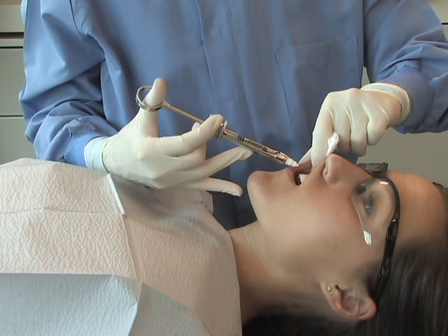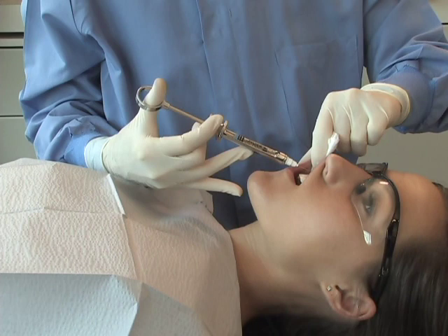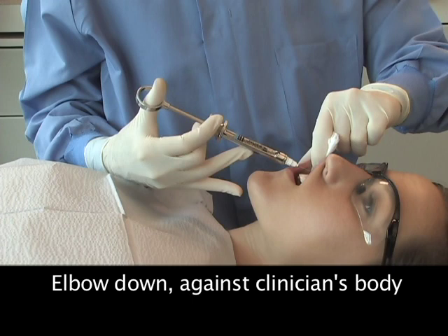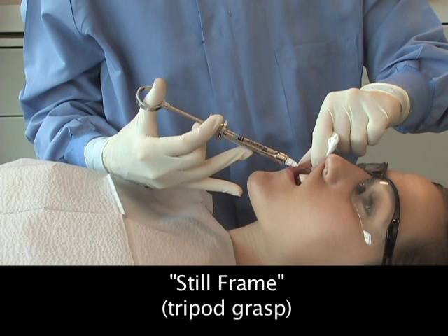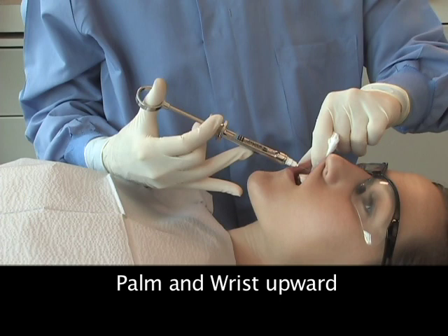Always attempt to fulcrum. The clinician should always attempt to obtain a stable fulcrum. There are several fulcrum positions that can be employed to assure stability during the injection. Keeping the elbow down and as close as possible to the body offers more stabilization than an arm that is elevated and in a still frame position for the entire minute it takes to deposit a cartridge.